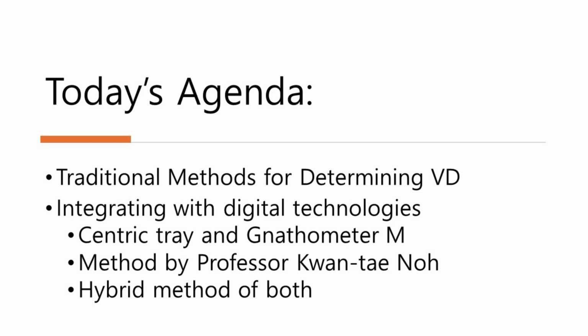For our third approach, we will discuss a modified version of Professor No's method, where an individual tray is used to acquire the final impression, vertical dimension, and centric relation all at once. Our aim today is to give you a clear understanding of how these methods can improve precision and efficiency in your practice. Let's get started.